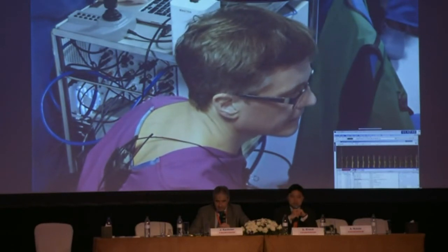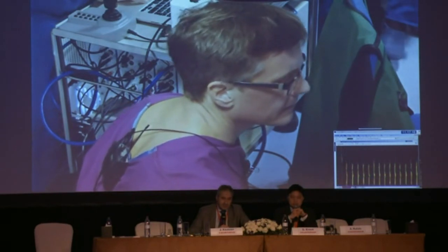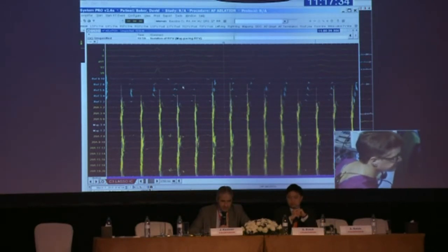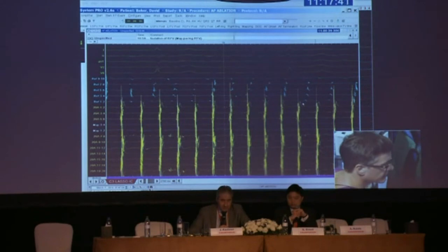So here, can we have the signals enlarged, please? So have that on the big screen. Thank you. So here you can see that it's clearly random, it's clearly irregular, but there is a pattern. So although the proximal does become earlier than distal occasionally, in the CS it's generally distal to proximal. Generally the PV is faster than the CS, suggesting that whatever is driving the AF is closer to the PV.